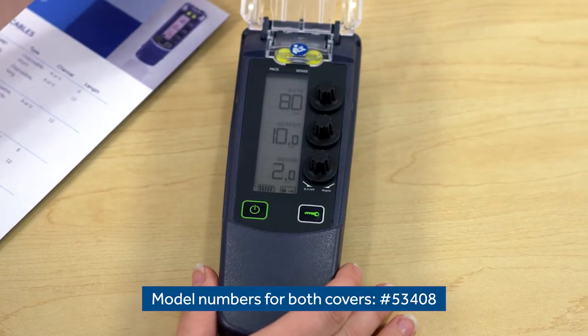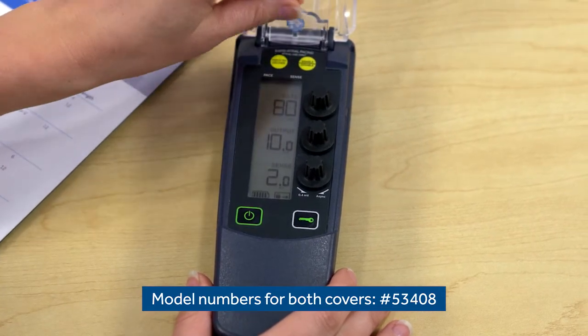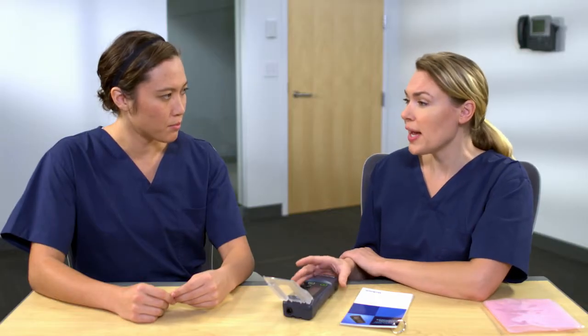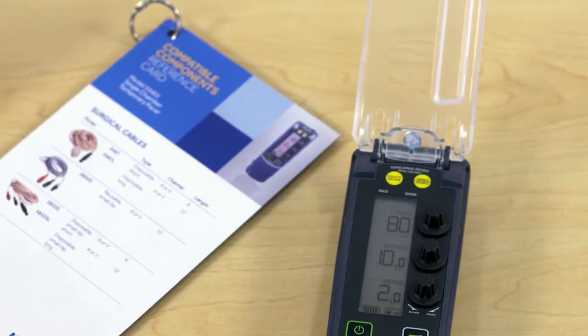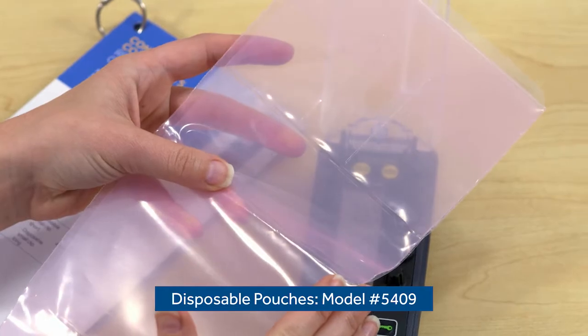There's a protective cover that helps keep the device clean. There's also a protective cover for the rapid atrial pacing controls. Both are removable and replaceable. The protective covers keep the device clean, and they're also a safety feature used to prevent the accidental manipulation of controls. There's another great way to keep the device clean — there are disposable pouches sold by Medtronic.